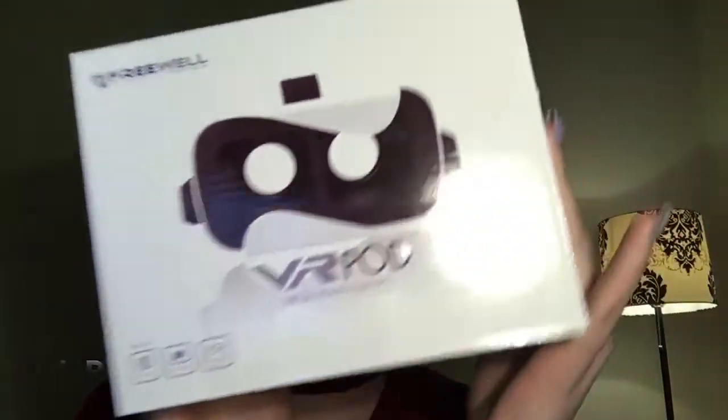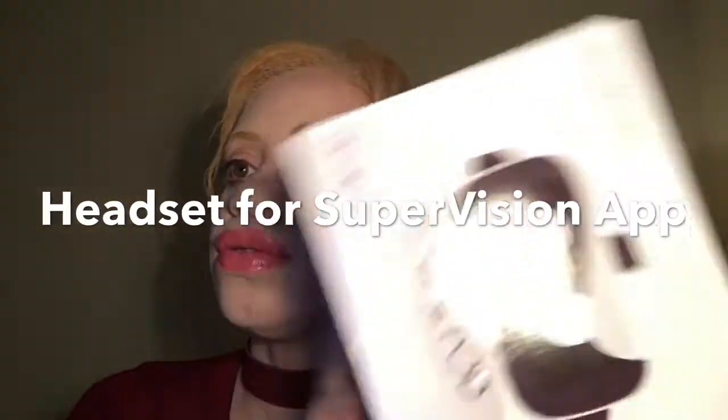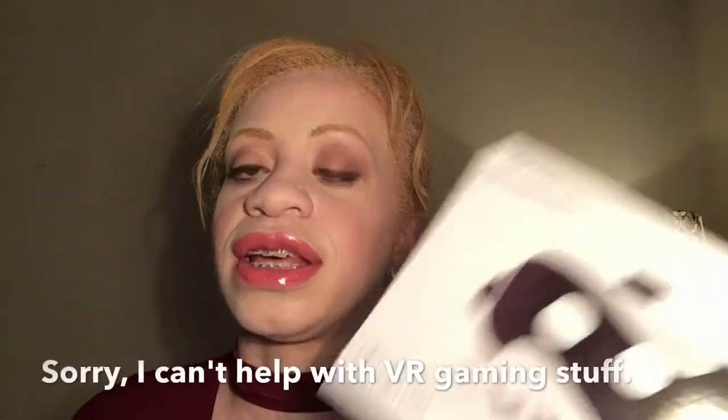Hey guys, I've got something new to unbox today — this is the VR Pod virtual reality glasses by Freewell. I needed a VR headset because I am looking for something that I can put my phone into to use the Supervision app, and I'm using this not for the purpose of playing virtual reality games or anything like that.